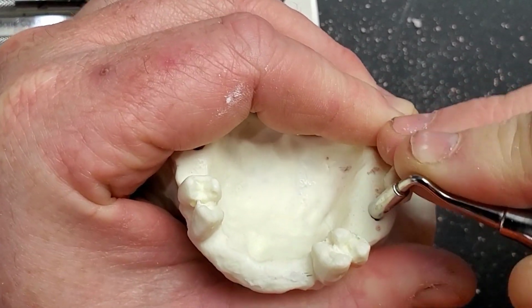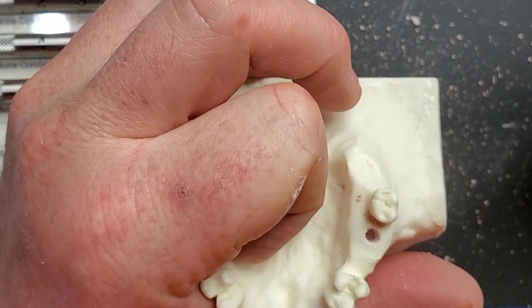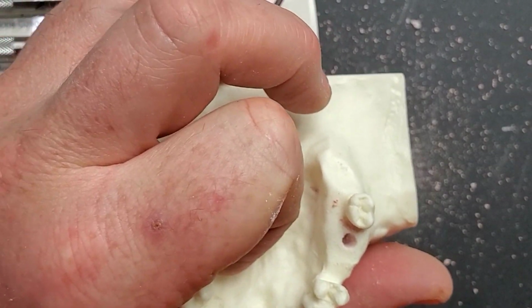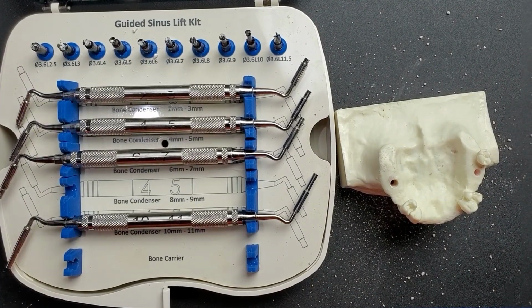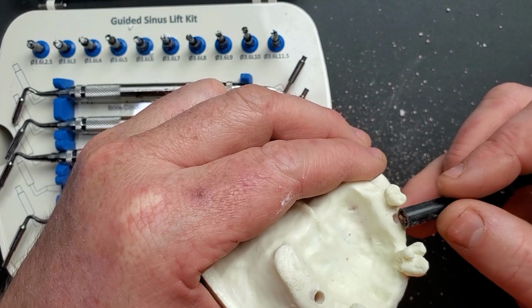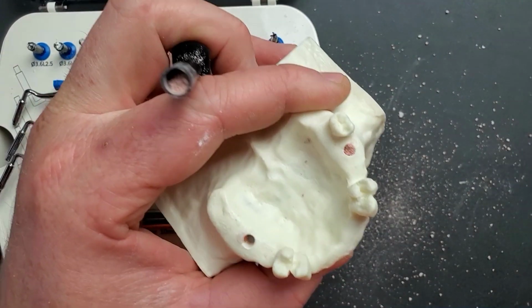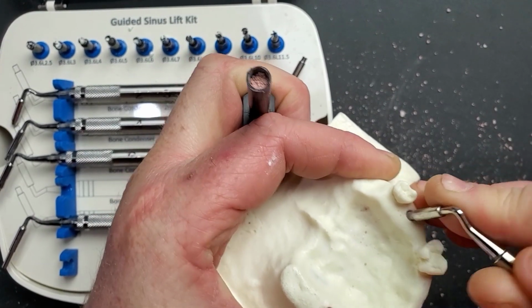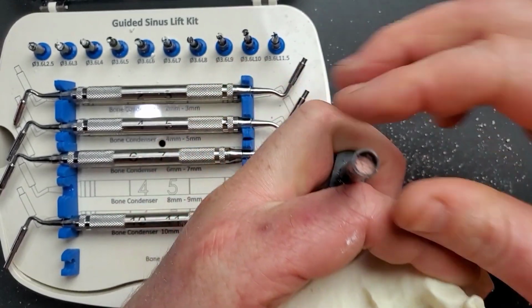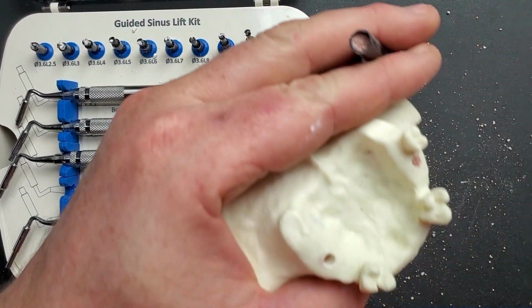Now some people also like to, before they start introducing any kind of a graft material, put PRF in there. That would be my preferred material to use, or if you don't have access to a blood spin, you could use a collagen plug. Collagen plugs work great. I usually cut them into halves or into thirds, and I would poke those little pieces up into the sinus membrane, and I'm just creating a bit of a cushion so that as I introduce the graft material, if there's any sharp edges, it's not going to come in contact with the membrane. Rather, that PRF or the collagen plug would do that. So we're getting close now.